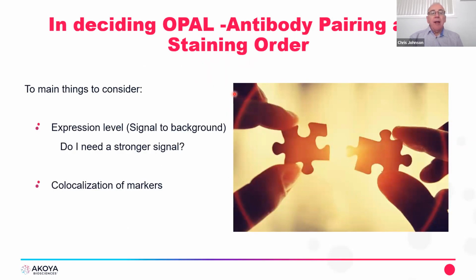So deciding then the Opal order, okay, which dyes go with which? Well, then it depends upon the expression level, signal to background, do I need a stronger signal, do I need a weaker signal, and basically co-localization of my markers.